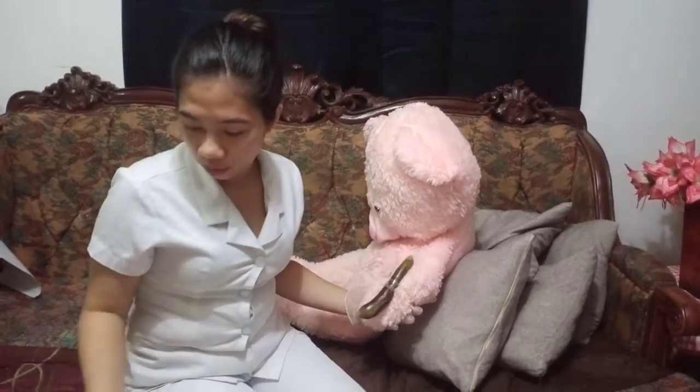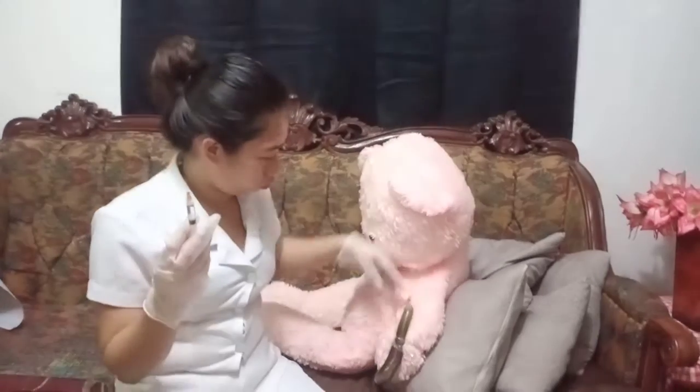So we're going to remove the needle cap and discard it. Then inject the medication using the Z-track technique. Then use the ulnar side of the non-dominant hand to pull the skin approximately 2.5 centimeters to the side.